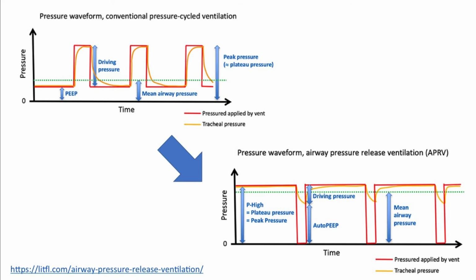And this doesn't show spontaneous breathing, but it works best if there's a little bit of spontaneous breathing all the way through, over the top of that waveform.